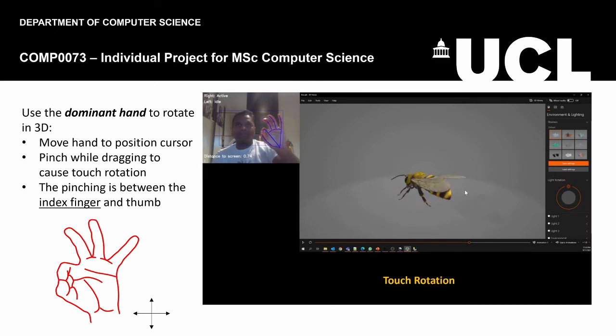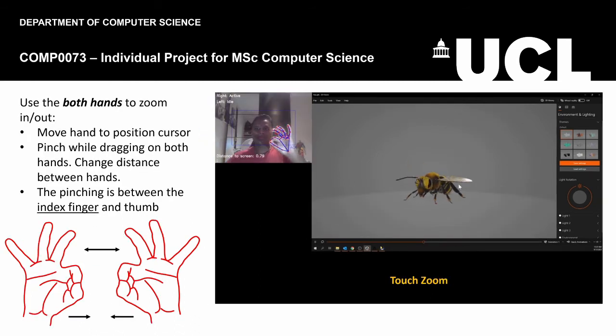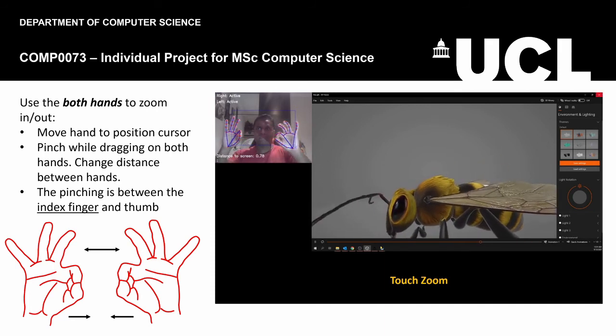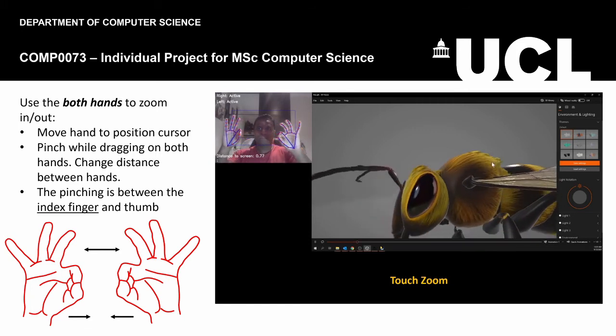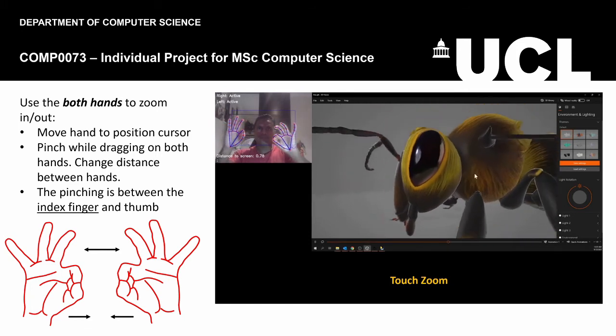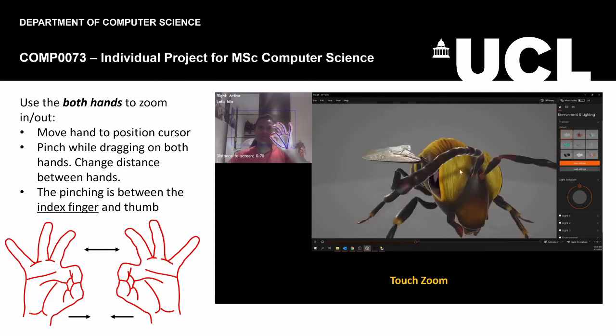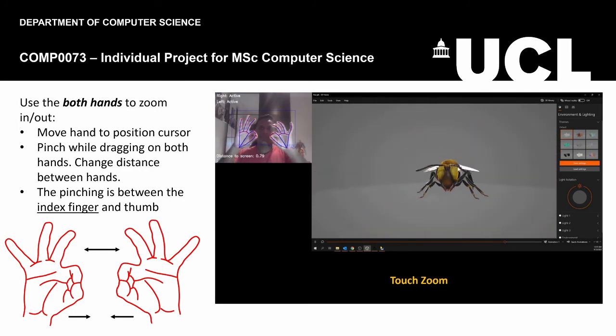Touch rotation is basically identical to how it was in the HoloRepository, except this time round we're using touch events instead of mouse events. Touch zoom is quite similar to how it was in the HoloRepository, except this time we're using an index pinch on each hand, and to show how precise this is, I'm attempting to zoom into this bee's eye, and this is just emulating that double finger contact that you saw in an earlier demonstration and moving those fingers together and apart.